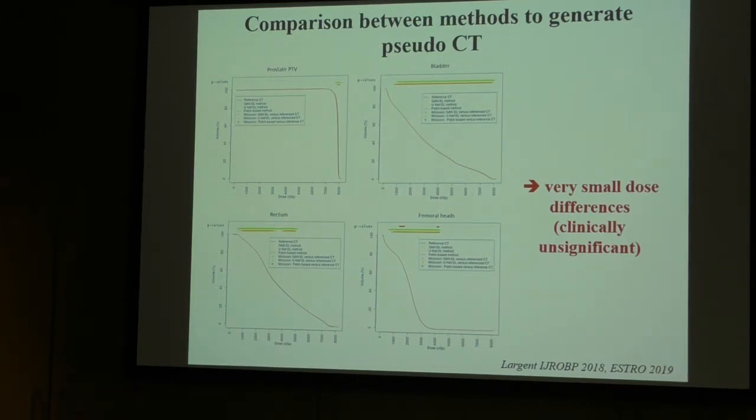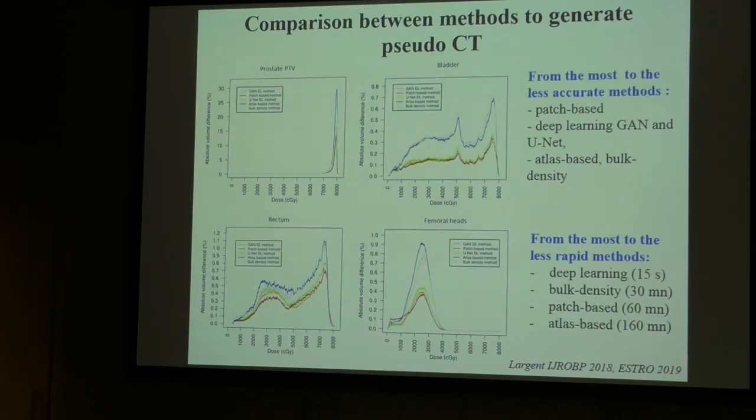in terms of dose distribution is very small, almost insignificant. Looking at all these 5 methods, the DVH, including the reference DVH, they are almost the same, usually. It's true that when you look very carefully, by subtracting the DVH of each method from the reference DVH, there are differences in the accuracy of the methods.